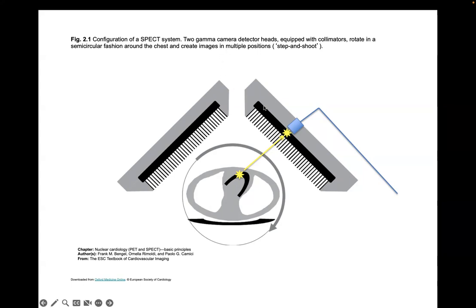So in this system, we're getting 2 projections at once. You can imagine if it was even more efficient, you could have a detector down here and a detector over there. You would get all of the photons coming out, because they're coming out in all directions, right? So when we have this septa here, we're wasting a ton of photons, right? Because there's a lot of photons going in every direction, but we're only picking up the ones that are parallel here or parallel here at this time.